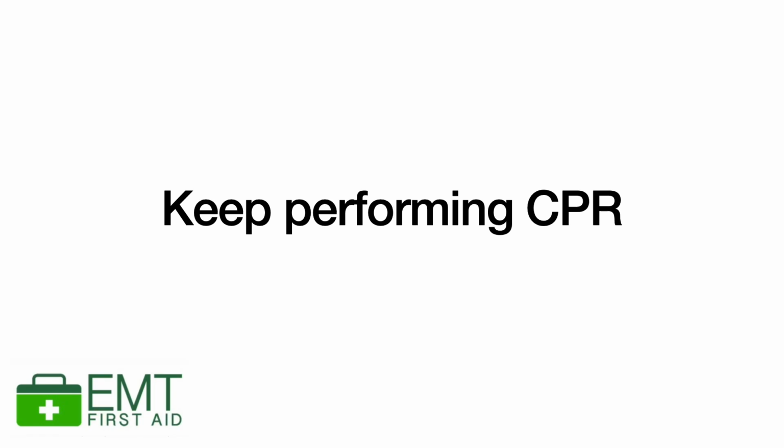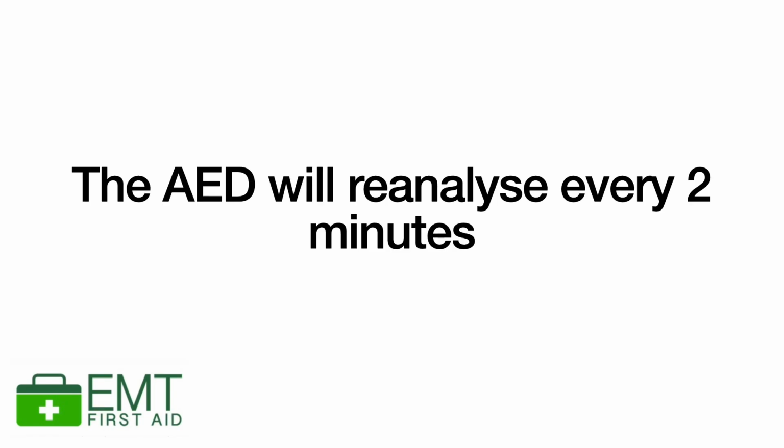And just keep on performing CPR, 15 chest compressions, 2 rescue breaths until the machine tells you it's reanalysing or, of course, the emergency medical services arrive.